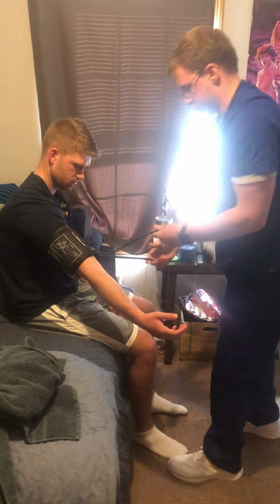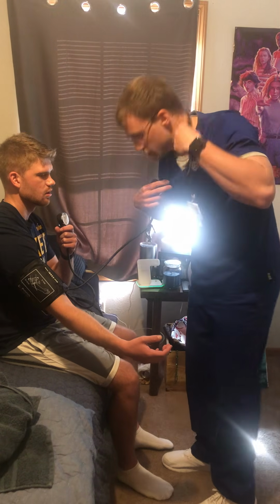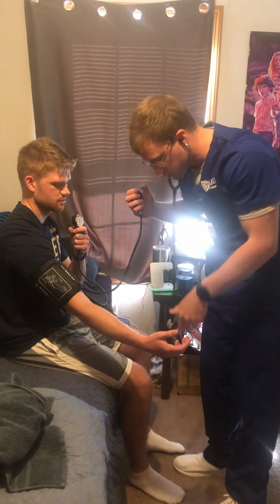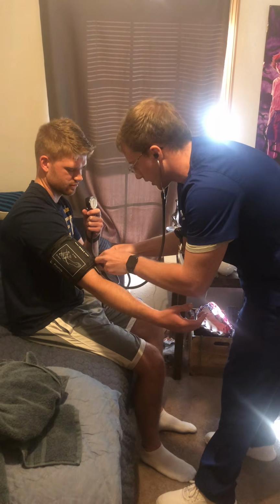Alright, and then if I could have you hold this up for me. And Braden, what's your normal blood pressure, do you know? I think 144 over 80. Alright, so I'm going to make sure that I inflate it about 30 above his normal blood pressure and take that into consideration.